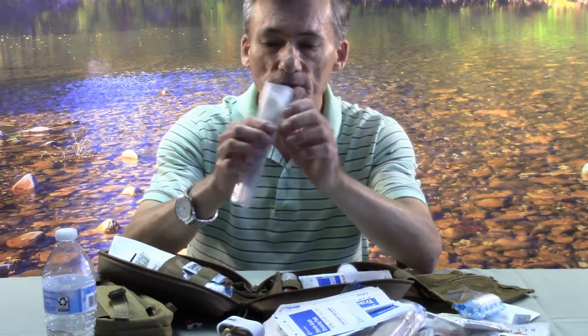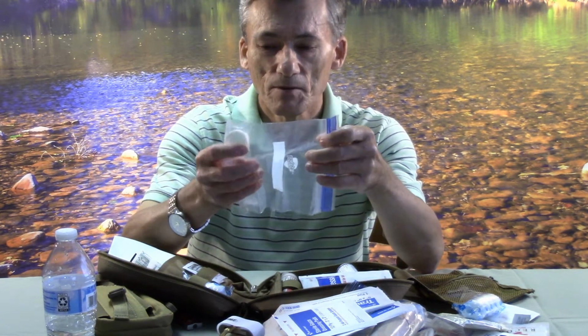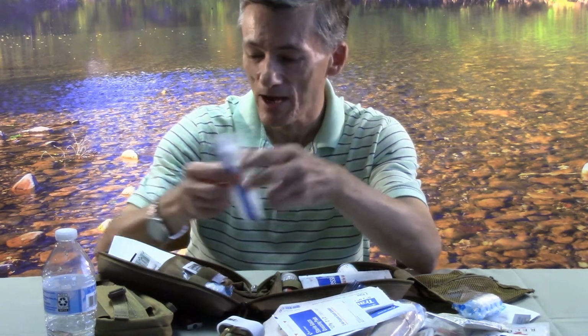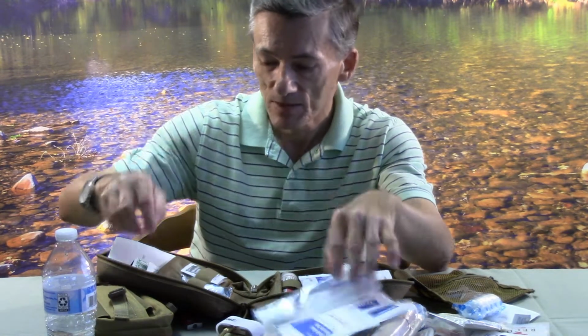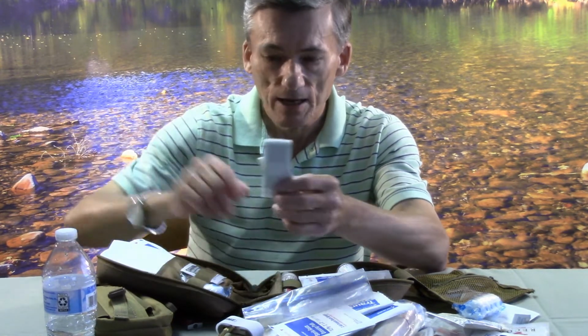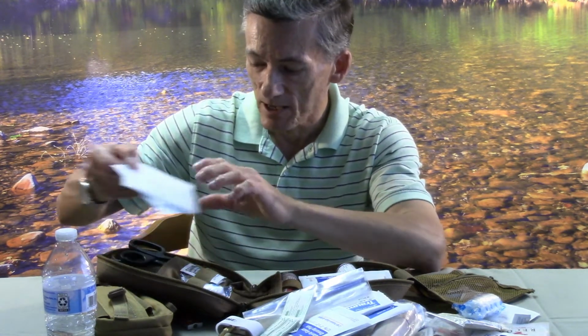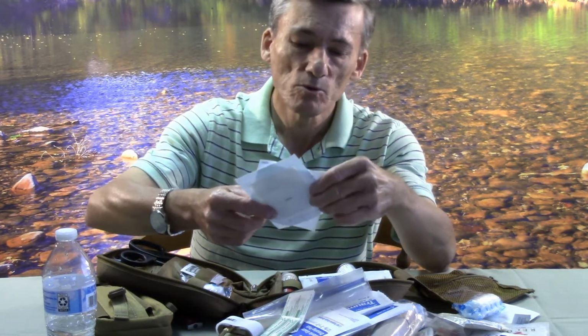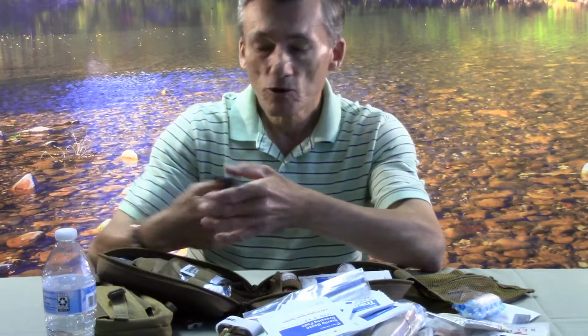A little bit of tape. Now, I stuck it in here because otherwise I'd lose it. But it's just a little Ziploc bag. I threw it in there. Keeps it nice and convenient. I know right where it's at. Your Band-Aids. Don't have to explain how to use those. More sterile gauze. Trauma shears.